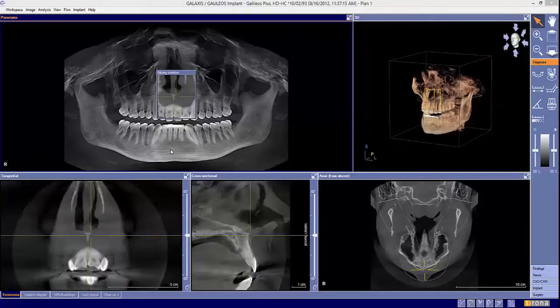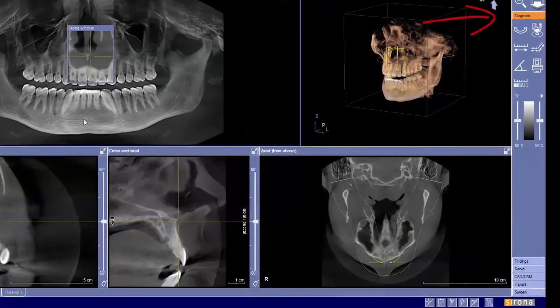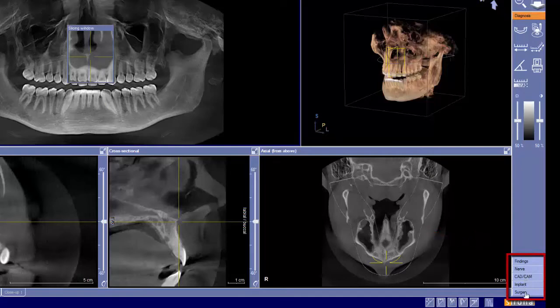Let's get started. Let's make the pano look its best. We can do this by optimizing the pano. On the right-hand side are tabs. The first tab is diagnosis, followed by findings, nerve, CAD CAM, implant, and surgery.